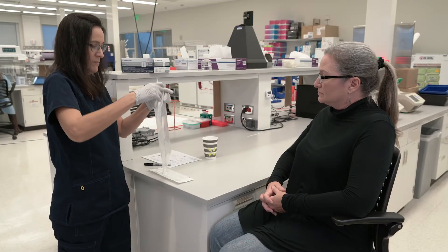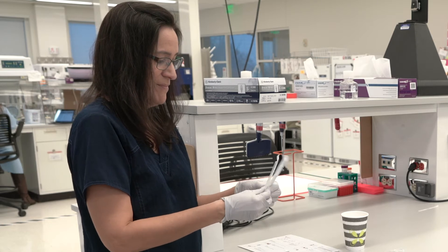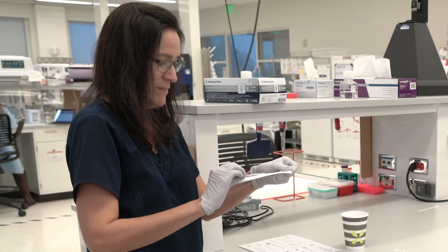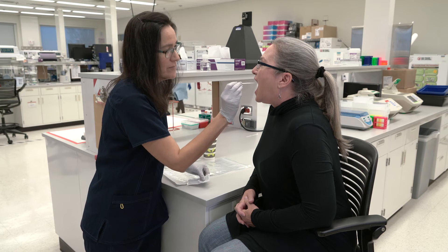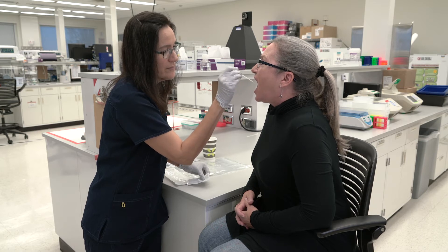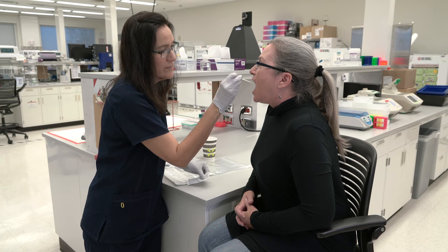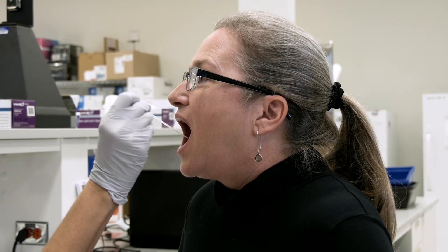Next, tear open the package from the bottom and slide out one swab. Hold it by its plastic shaft. Remember, do not touch the DNA collection swab tip. Ask the subject to open their mouth wide and carefully, without touching the DNA collection tip to any other surface such as teeth, place the tip of the DNA collection swab against one side — the buccal or cheek side — of the mouth.